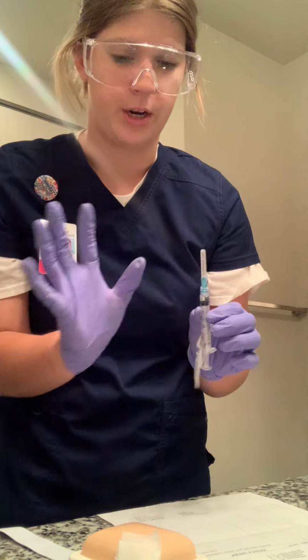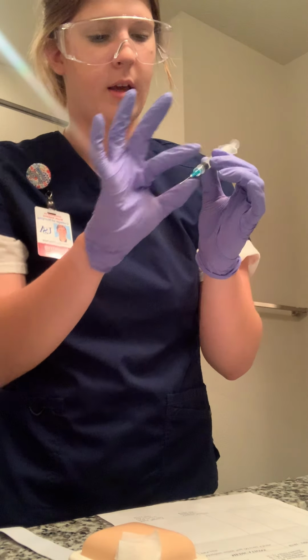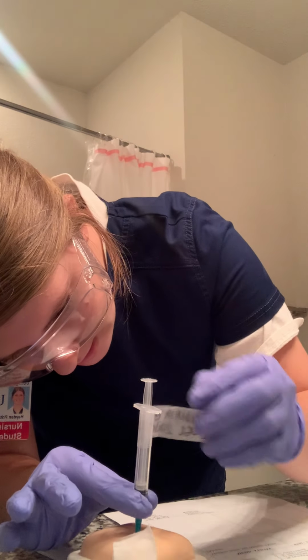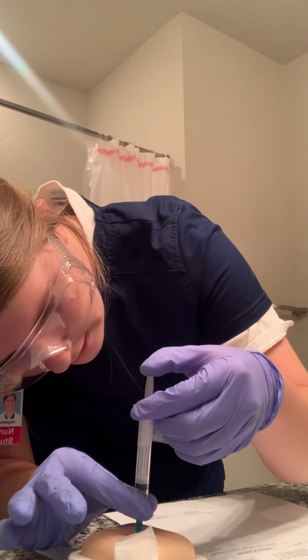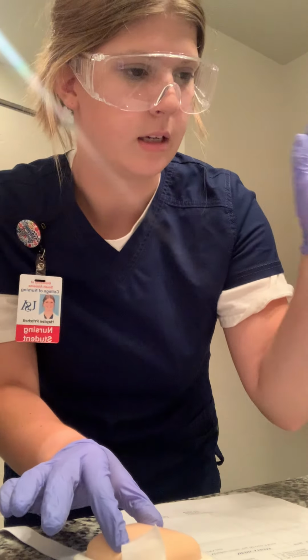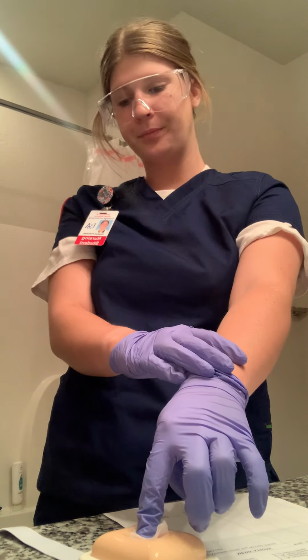So now, after I know it's clean and I've cleaned the area, I'm going to take my lid off, and I'm going to hold that skin real tight, and I'm going to shoot it in, and I'm going to aspirate. No blood, and now I'm going to push it. Okay, now it's done. I can dispose of my sharps container, and I'm holding a little bit of pressure.